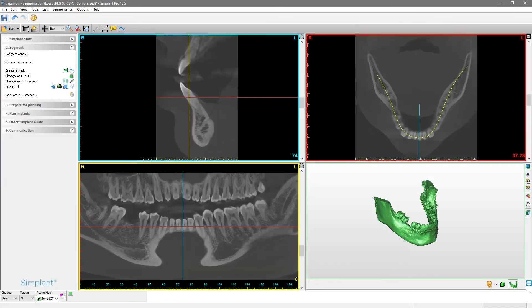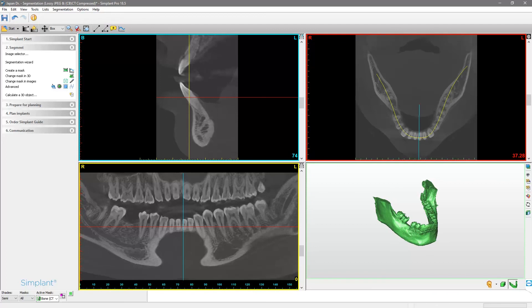Please note that Simplant Pro has more advanced tools that allow you to create impactful 3D models that will help you better engage with your patient. Please review Simplant Pro help pages for more information on how to get the most out of Simplant Pro or contact our customer support.